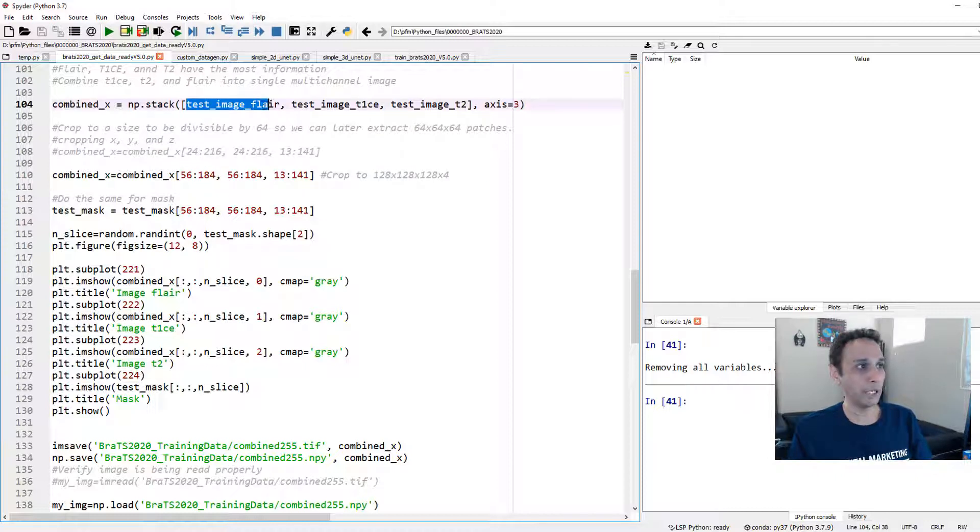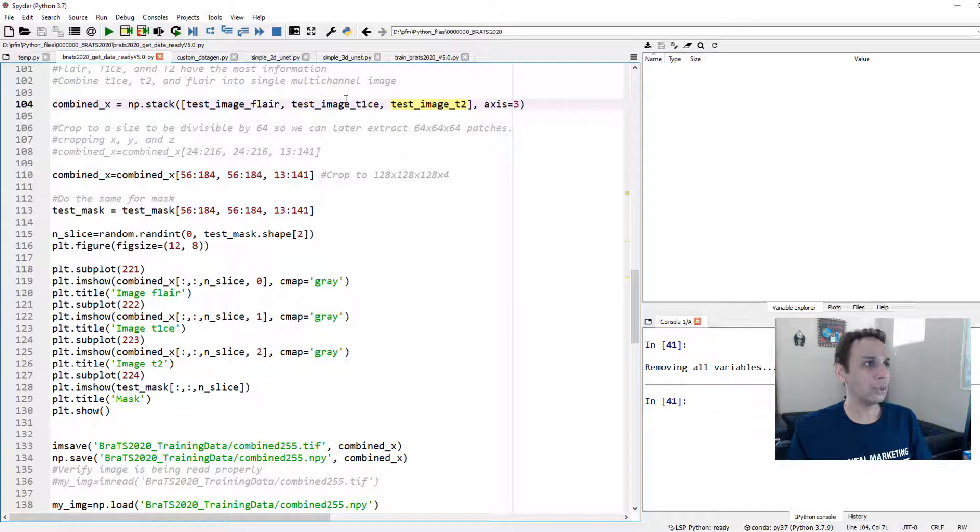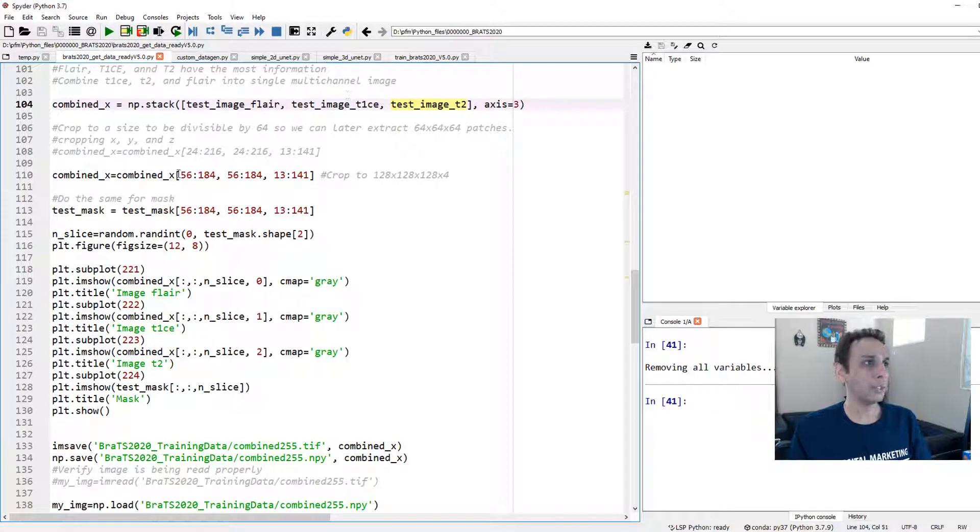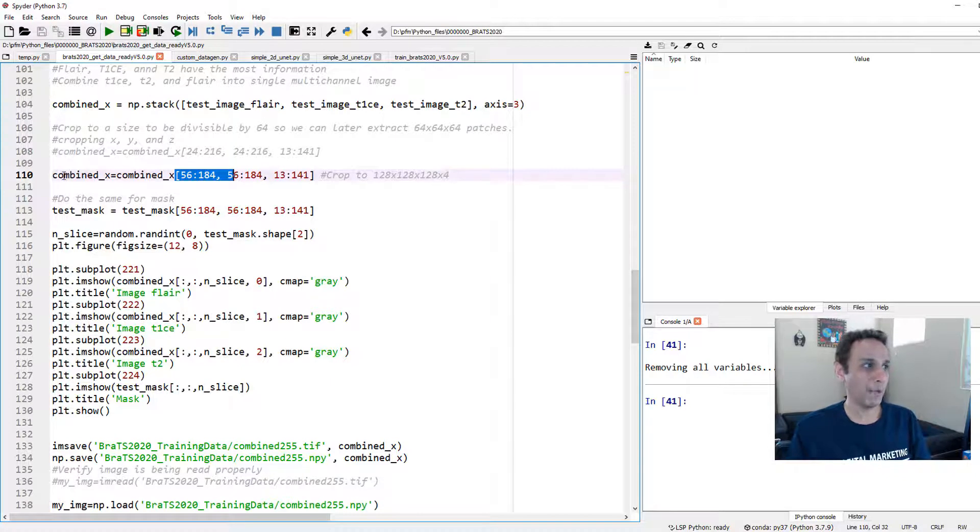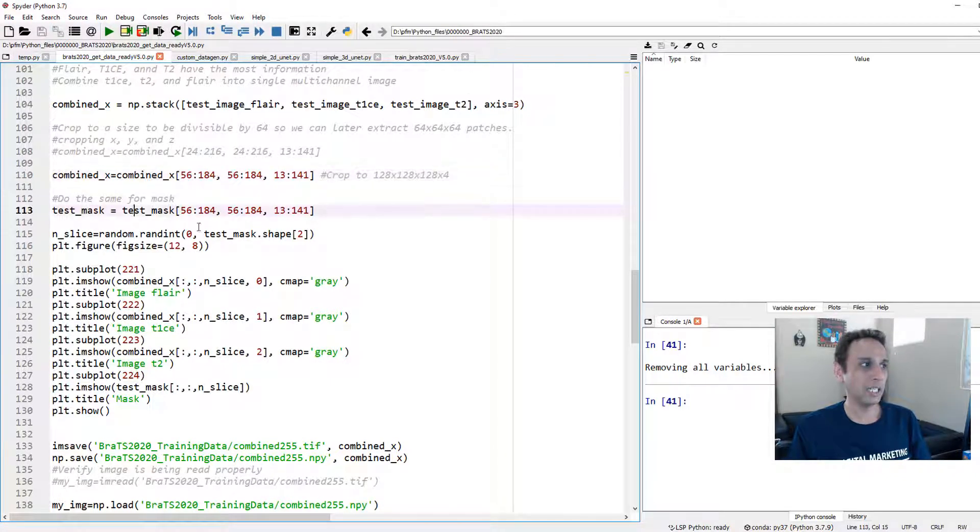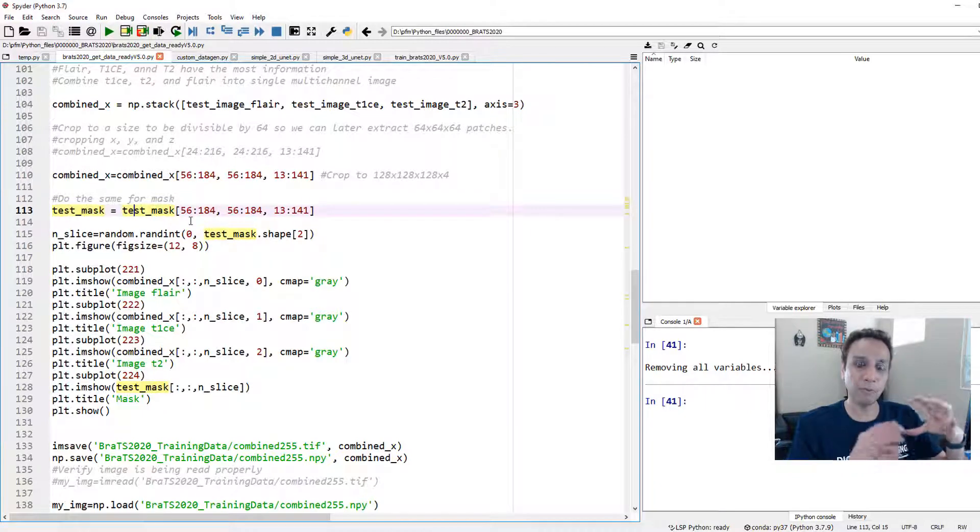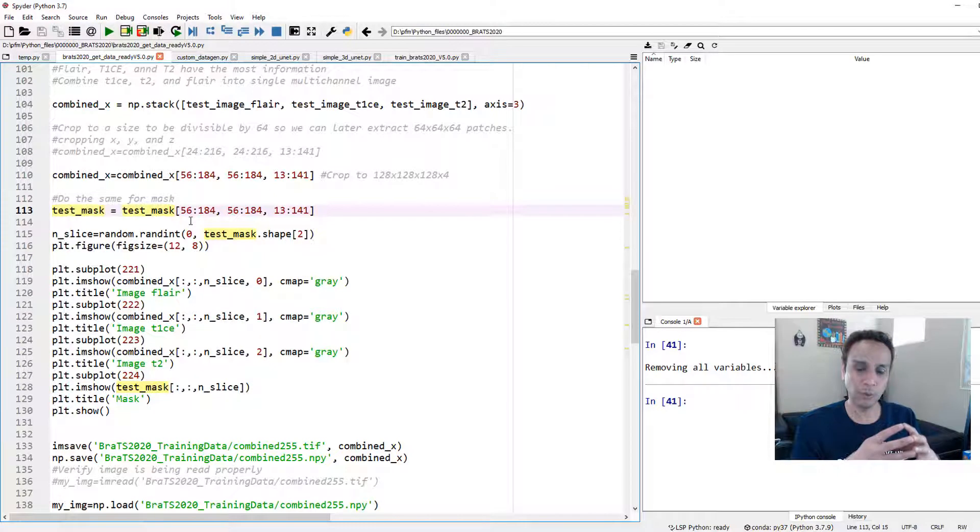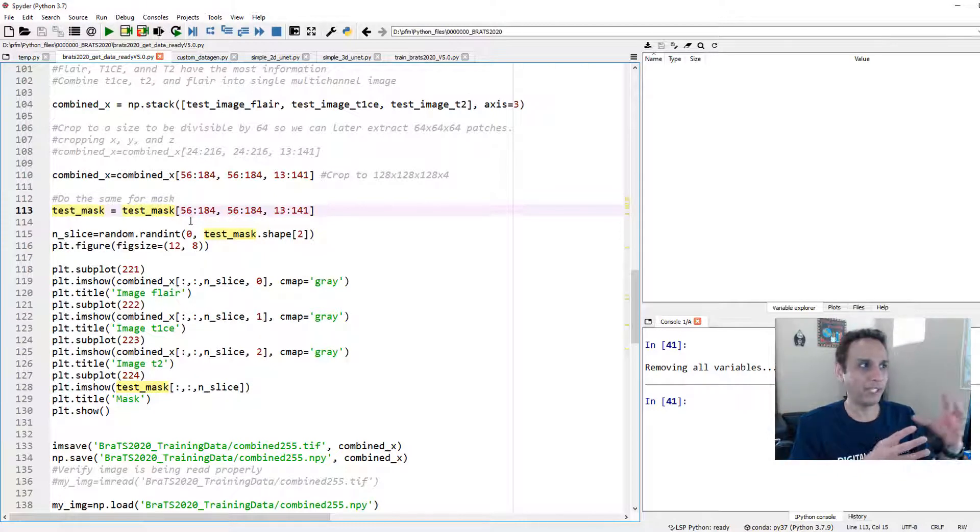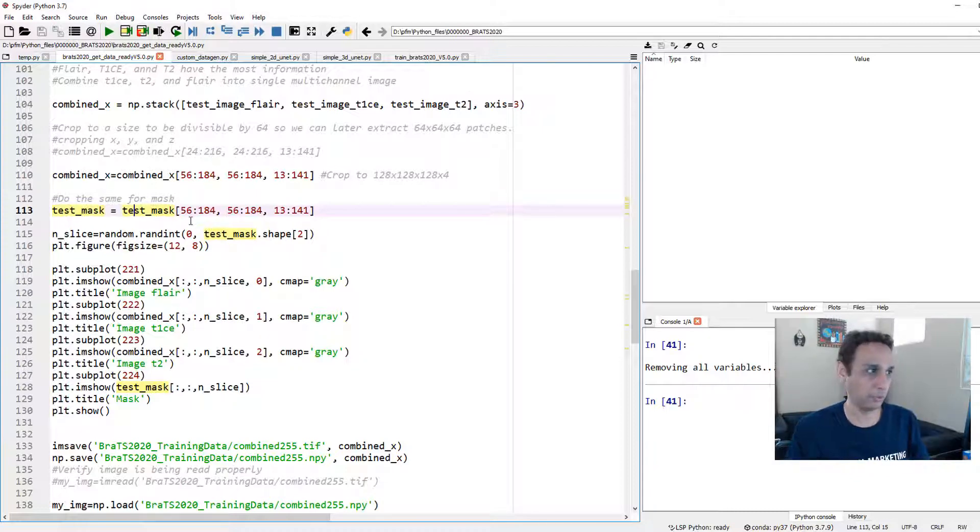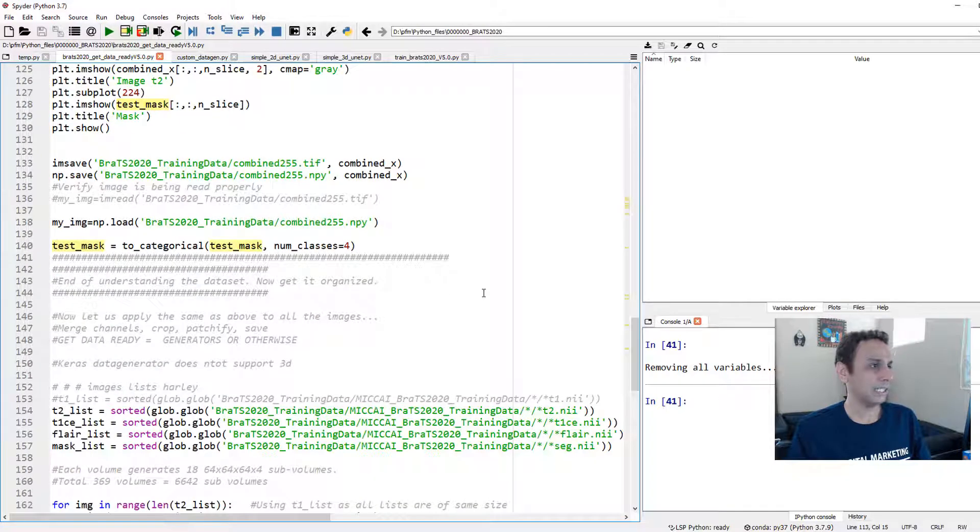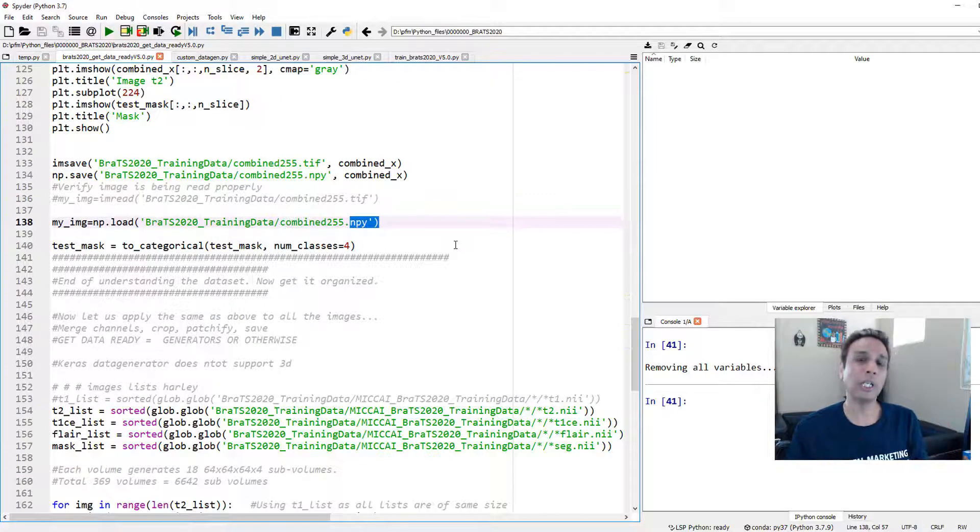Once we have these images minmax scaled, we are combining them into a single NumPy array. So I'm combining only the FLAIR, T1CE and T2 and ignoring T1 for now. If you want, you can add T1 and experiment to see if that adds any value.